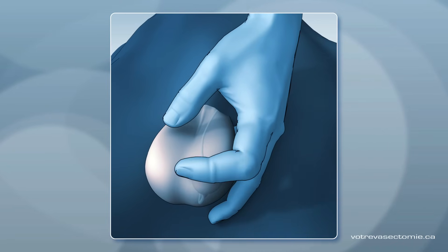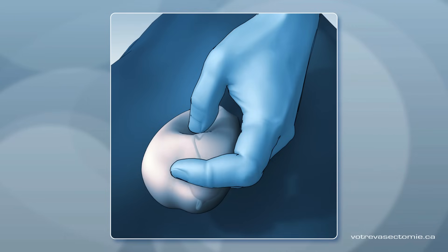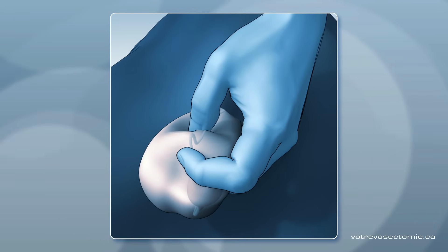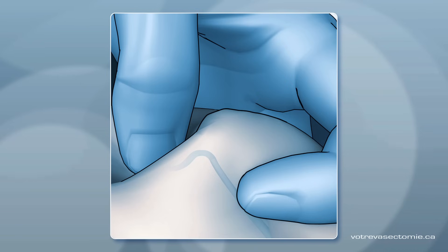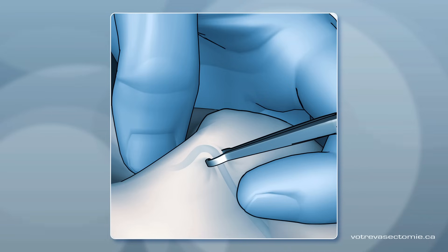After local anesthesia, the doctor feels the tube under the skin and, using his fingers, brings it towards the surface. Then he immobilizes the tube under the skin using a small, round clip. You feel absolutely no pain as the skin and the tube are anesthetized.